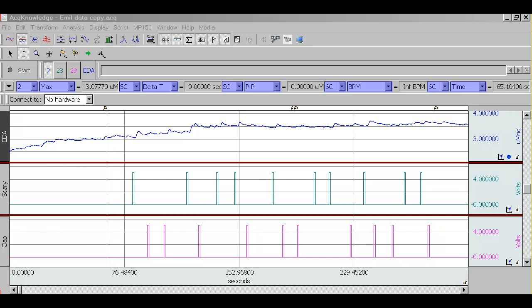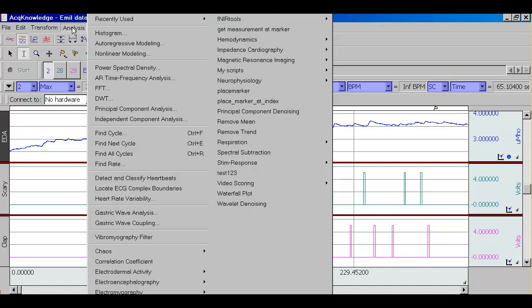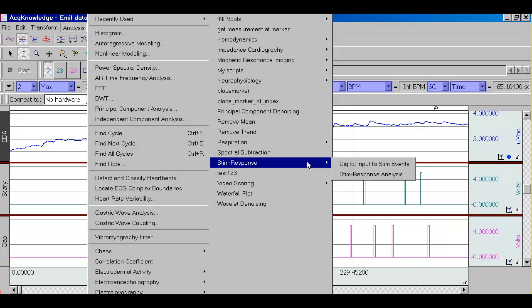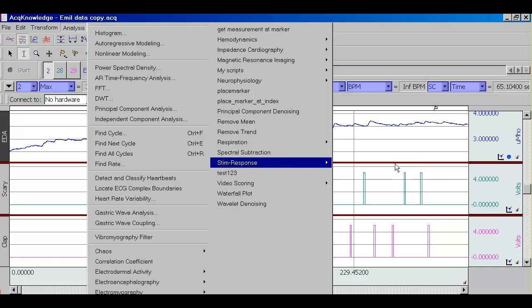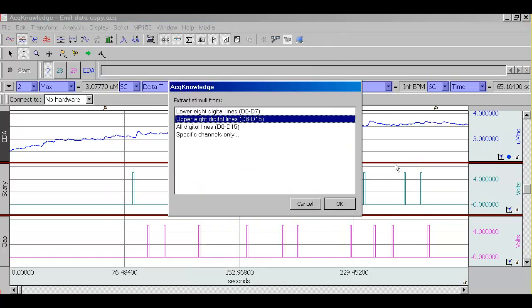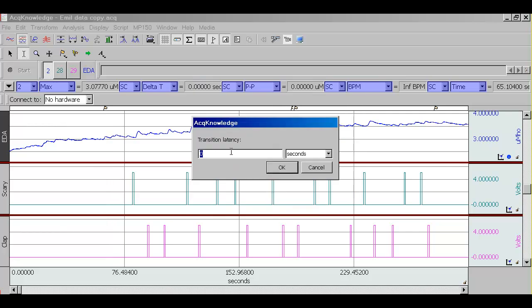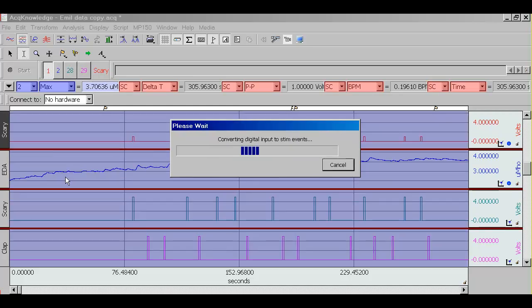The first step is to have ACKNOWLEDGE convert these pulses to stimulation events, to markers in ACKNOWLEDGE. There is an automated procedure to do this. In this particular instance, we have received information on digital lines 8 to 15. You can also choose specific channels if you have been receiving information on analog channels. This particular setting is for more advanced work where you're sending all kinds of channels of information corresponding to markers. We do not need to do anything right now.